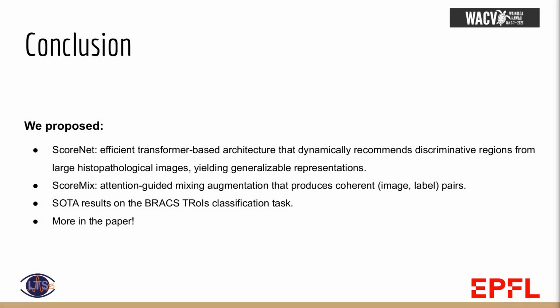To conclude, we propose ScoreNet, an efficient transformer-based architecture tailored for megapixel histology images. Along with it, we devised a mixing augmentation strategy that is based upon the same underpinning principles. These contributions were thoroughly tested and yielded state-of-the-art results on the BRACS classification task.